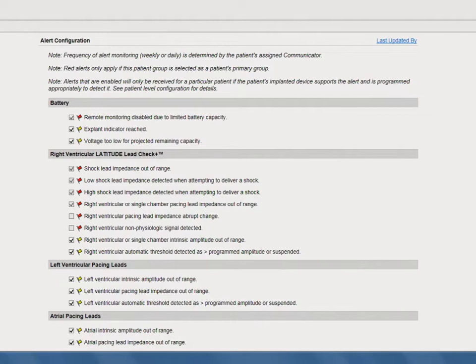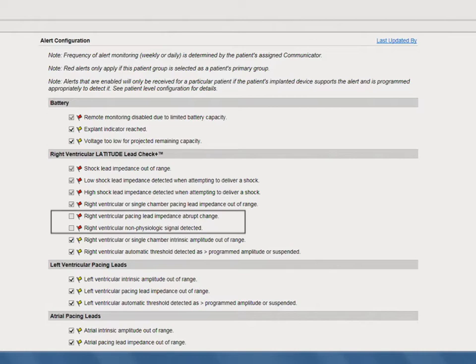Red alerts are always on and cannot be configured, with the exception of the Latitude Lead Check Plus alerts. These two alerts, designed to monitor leads under advisory, are nominally off and can be selected for an individual patient by editing the patient's alert configuration. Red alerts are only available to the clinic associated with the patient's primary patient group.